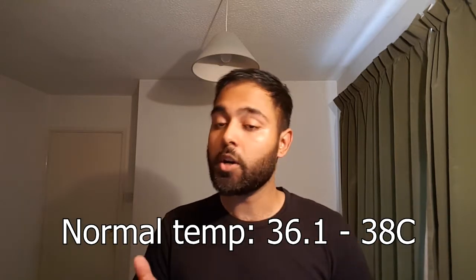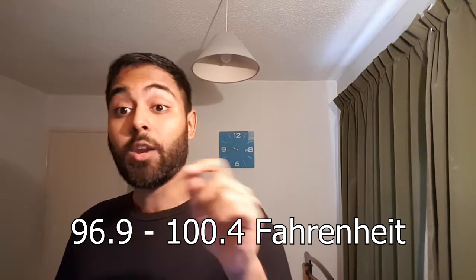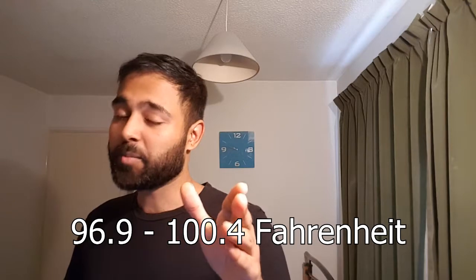The next vital sign is temperature. This is assessed using an electric thermometer and placing it into the ear. The normal levels for temperature are between 36.1 to 38 degrees centigrade. That's between 96.9 and 100.4 for those special people who don't know.